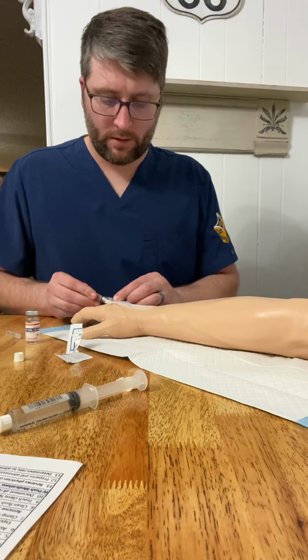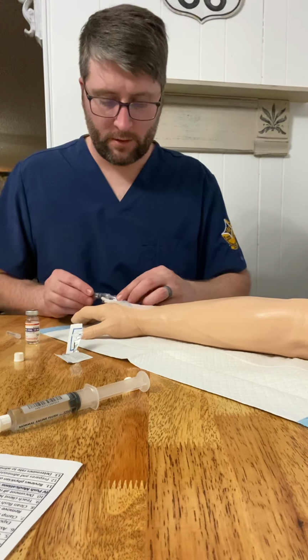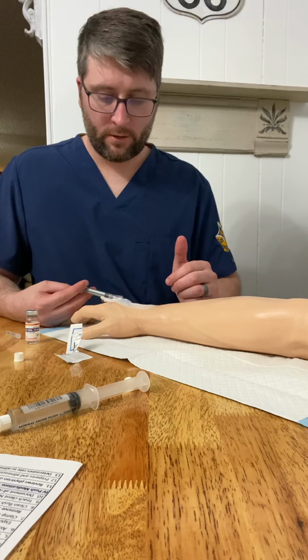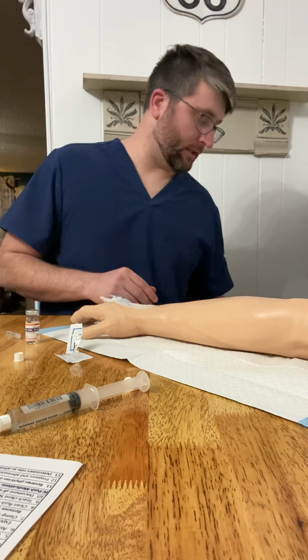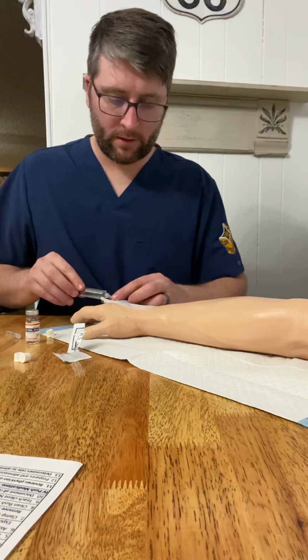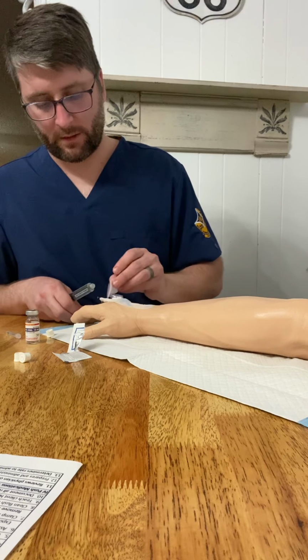Then we're going to do our IV alcohol swab again. Then we're going to give our medication, as it said, bolus. Give that, assess the patient to see if there's any kind of reaction, make sure they're tolerating the medication well. And then we are going to disinfect the site again with our swab.